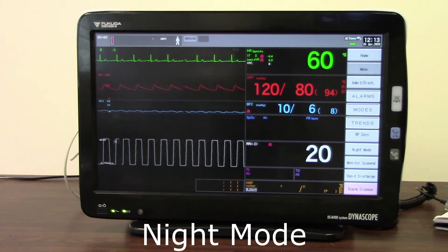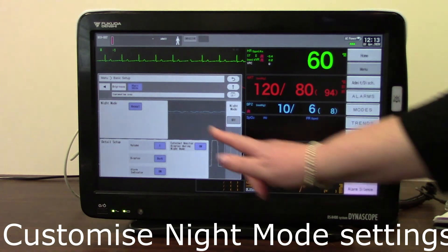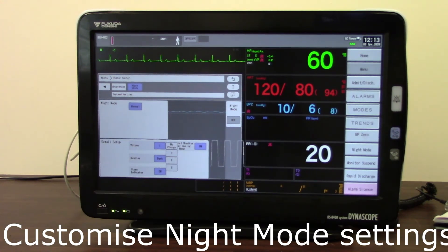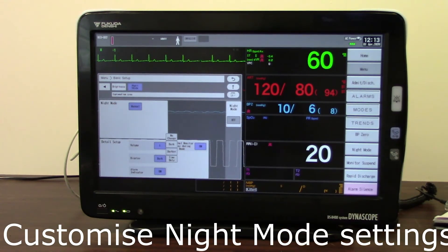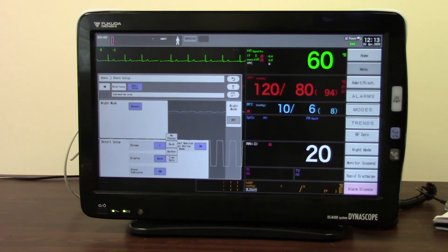If I want to alter the night mode settings, I can do this by going into the menu and touching the night mode setup button, which allows me to adjust any of these elements. I can make the volume completely silent, at level one, level three, or no change at all from what it's currently set at. I can also choose how dark I want my screen to be — left bright, dark, darker still, or time only. And I can choose whether I want my indicator lights to flash or not.